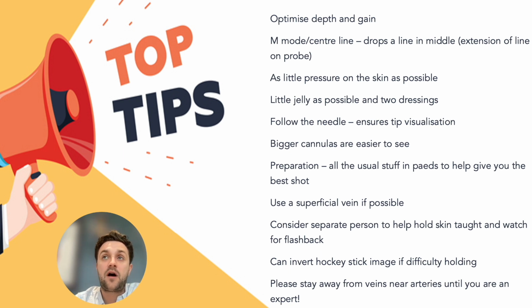And becoming an expert, it's probably best to practice this skill on easier patients, okay? Because it's going to be quite tricky for you to get the one that nobody can get on your first attempt, and it might be a good idea for you to practice on some adults, as it will be easier in adults before you try on kids, but you hopefully shouldn't have any too big an issues.